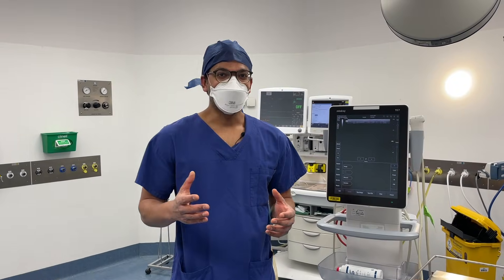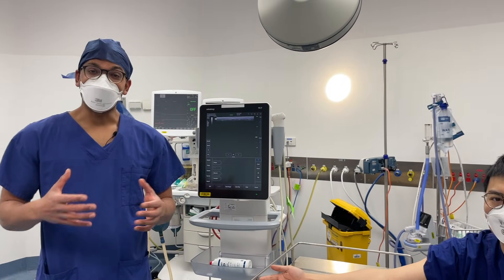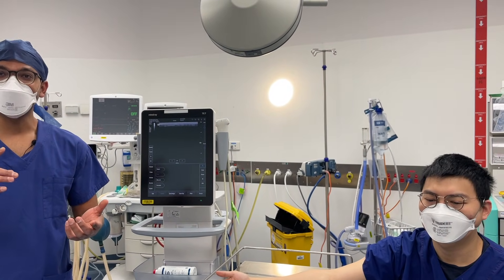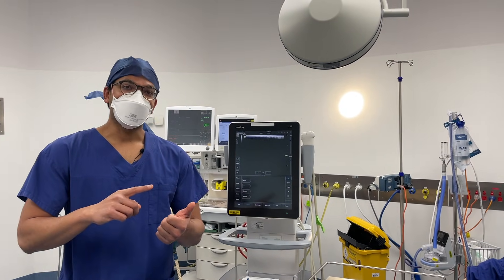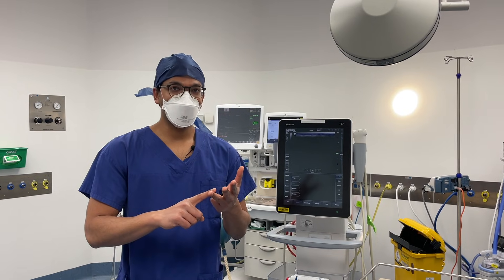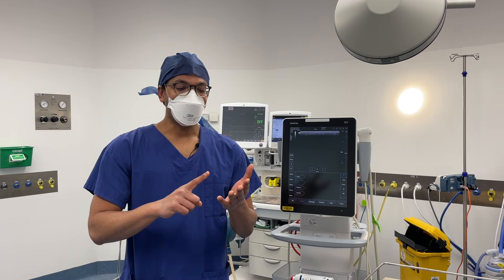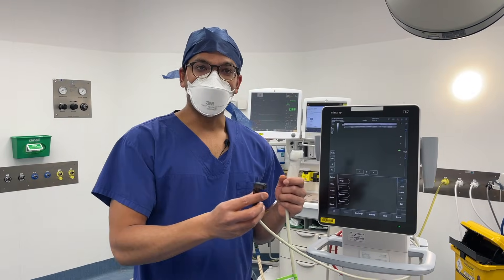I've got with me a very helpful volunteer who's going to help us demonstrate these techniques. Let's go through that framework — PP-DFG — which stands for probe, preset, depth, frequency or focus, and gain. We're going to show you that now. There are a couple of probes you could use.